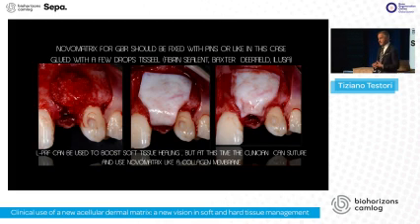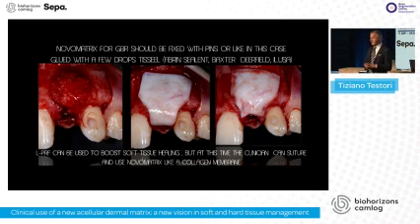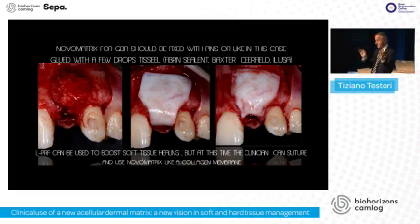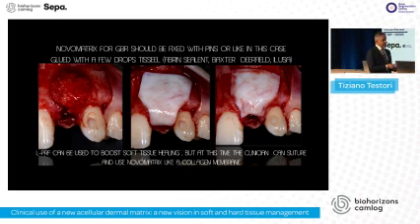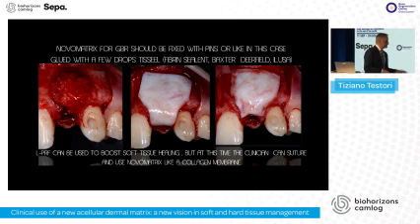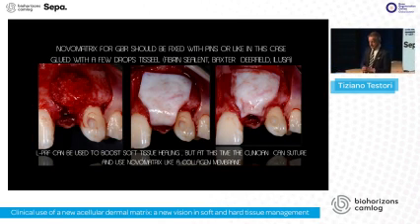sealant. And the fibrin sealant, you know, has been used for years in other fields of medicine, and the cost is the cost of 2 pins, and the Novomatrix stays very easily and very user-friendly, glued and stable to the underlying tissue. And this is L-PRF, which can be used on top of your matrices to boost the soft tissue healing.